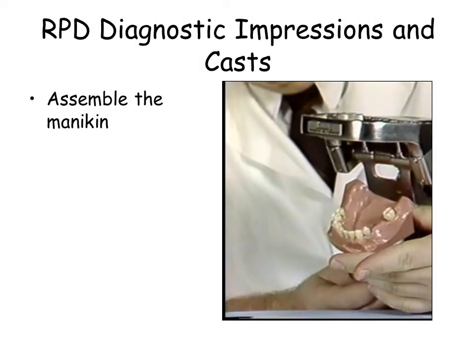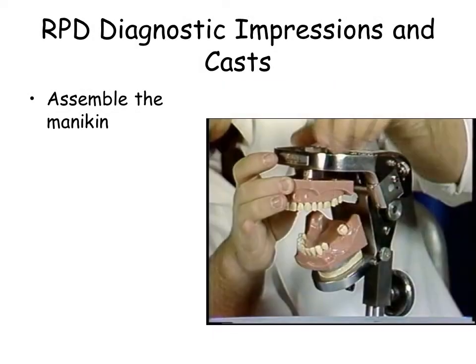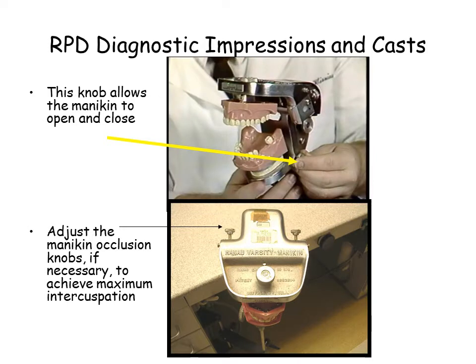Obtain a mannequin head from the core laboratory. It is important to use the same mannequin for all the exercises. Observe the knobs, which allow the mannequin to open and close as well as to adjust the mannequin occlusion.